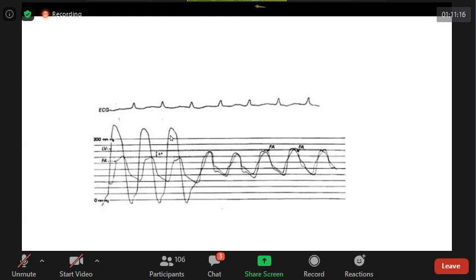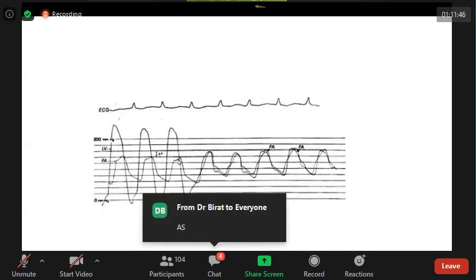Because this is a 200 scale, the left ventricular pressures are 240. You can see it is 240. So the pullback is taken, keeping this catheter from LV to aorta. What happened to the femoral artery pressures here? Once the catheter crossed the aortic valve, femoral artery pressure increased. Once the catheter comes out of the left ventricle on pullback, in other words, in a critical aortic stenosis, there will be a pressure rise.